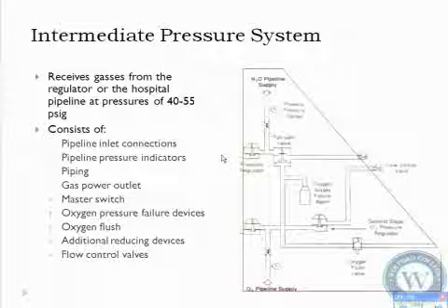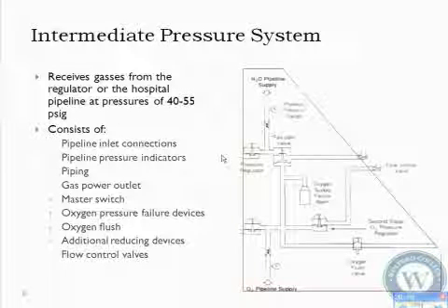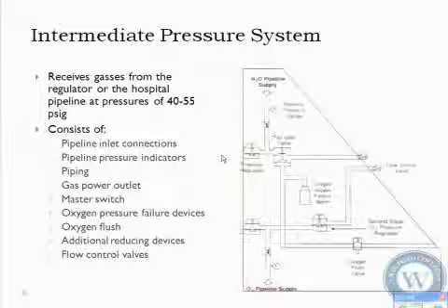why is it not super imperative that we don't push that valve when they're breathing in? The answer is that when you're spontaneously breathing, we have the expiratory side open. So they can exhale at pleasure. If we push that valve, it's going to immediately spill over into the expiratory limb too. It's just going to go out the scavenger system. It's not going to go to the patient and blow their lungs up.